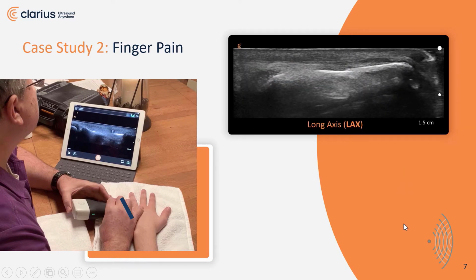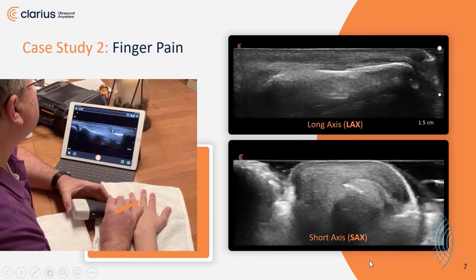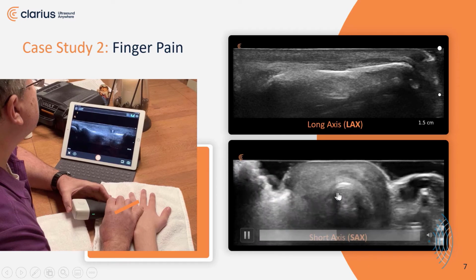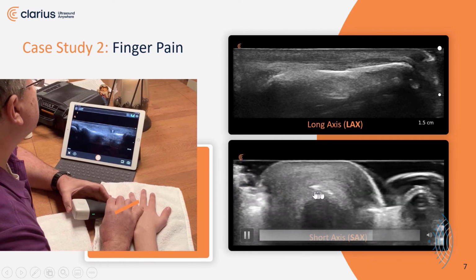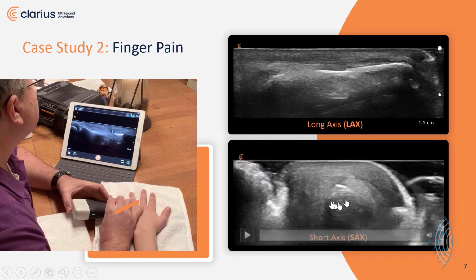And then as we take a look at the short axis, represented by the orange line in the picture, a normal echo texture of round finger bone shows up like an arch or a bright white crescent. As you watch me scan proximal and distal on this bone, there are going to be unique prominent points, almost like a shard that sticks up from that bony surface.